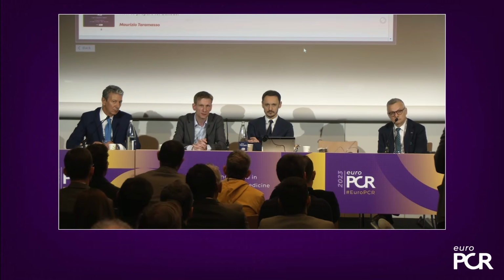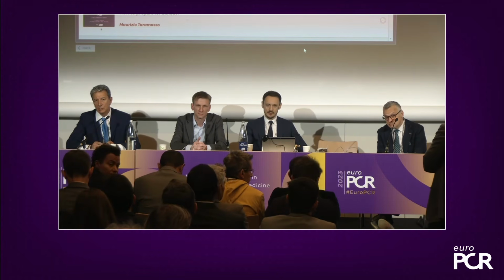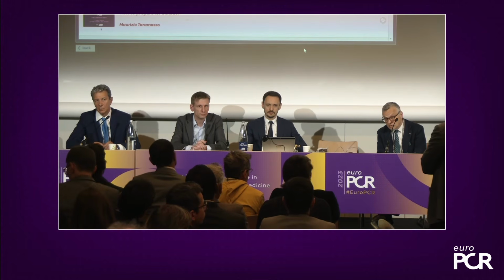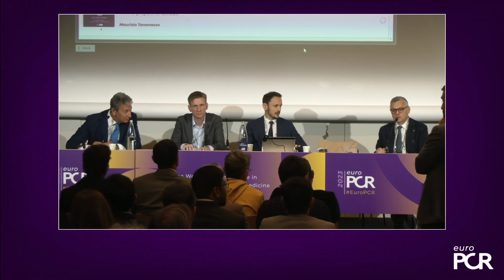Some colleagues automatically use one ProStyle Angio-Seal, for example, and then you close it off with the 6-French. Excellent way. My second question is, I watched your video and there was no bleeding, not even a leakage. Would you suggest that, or can we leave a little leakage just to be sure there is nothing wrong? There is nothing wrong with having some bleeding, just not occlusion.